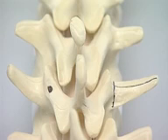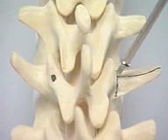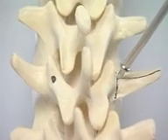In vivo, a small accessory tubercle may be present to aid identification of the entry point. This more medial entry point allows the angle of screw insertion to be closer to the median sagittal plane, but cannot be used at the proximal end of any construct. The pedicle awl is used to open the posterior cortex at the entry point.